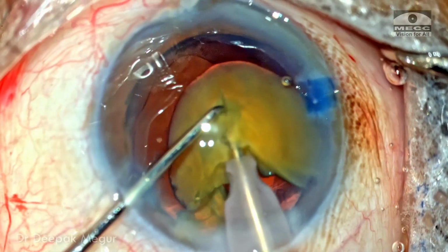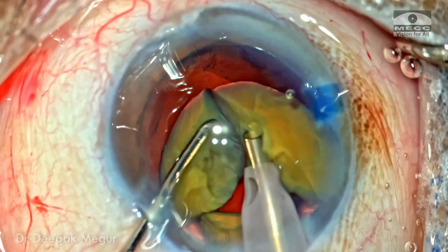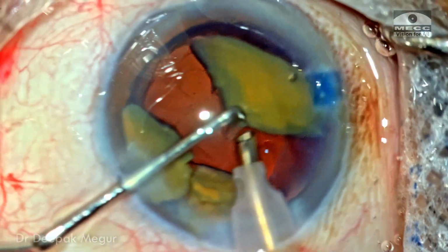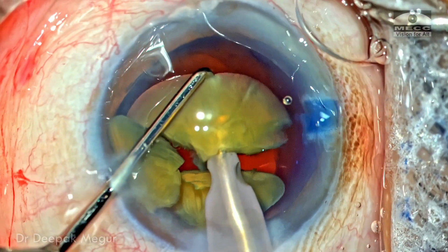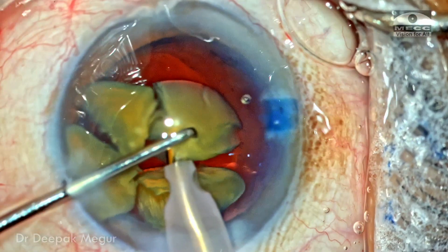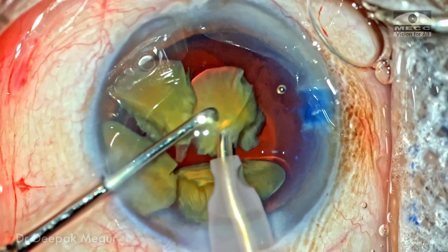The nucleus is rotated and the fragment is divided into two heminucleus. And the last heminucleus is now carefully, under close observation, being divided. So now I have got 4 quadrants to deal with. Each of these quadrants is then being emulsified.